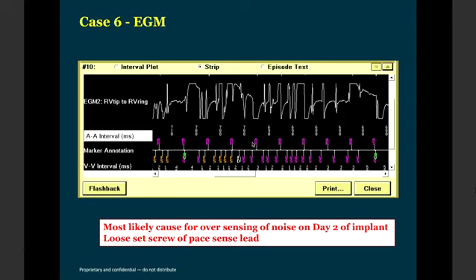So if a patient has a bradycardia indication and a significant atrial tachyarrhythmia burden, I would definitely prefer a dual chamber ICD as opposed to a single chamber ICD. For example, a patient with HCM has a high chance of developing atrial fibrillation in future, so I may prefer a dual chamber ICD. And if cost is not a concern, because SVT-VT discrimination is a lot better with the atrial electrogram, a dual chamber ICD is probably the preferred choice.